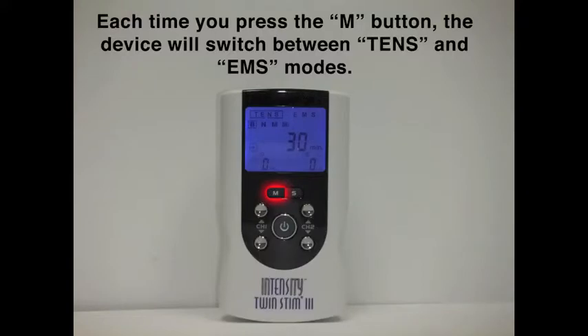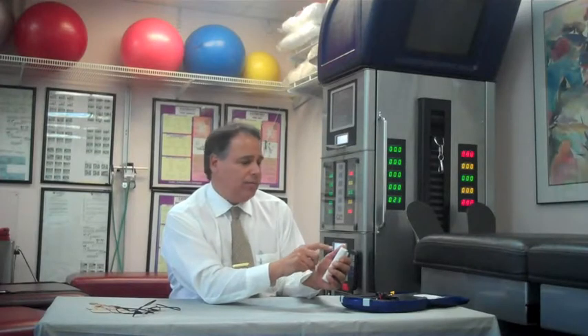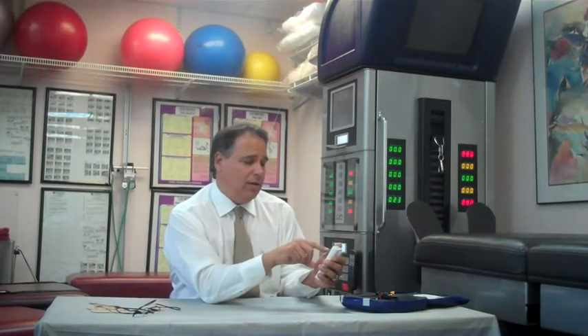We're going to go through the modes. If we turn the unit on, we'll see that it will go to EMS mode or TENS mode, depending on where you left off. By pressing the M, you can scroll back and forth from TENS to EMS. We have burst mode, normal mode, M, and M1 mode. In burst mode, the electrical stimulation will be felt in short bursts, followed by no stimulation.